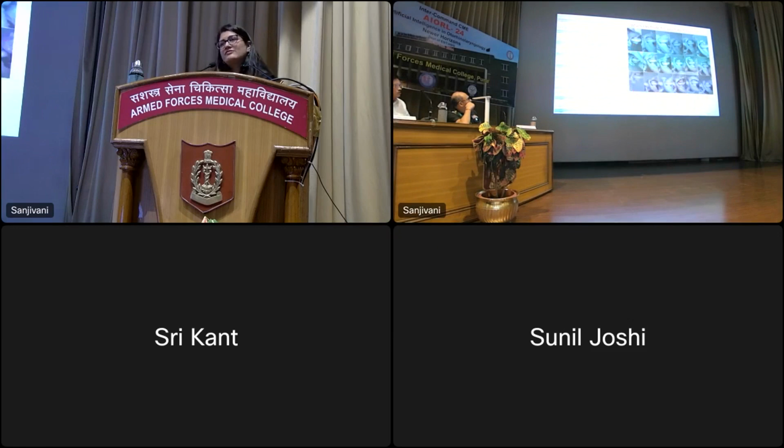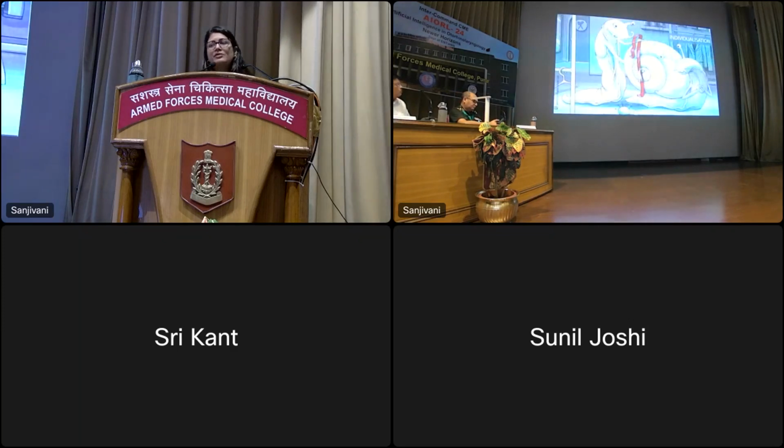So we need to understand the cochlear anatomy properly first. We need to take care of the parameters of the cochlea first to understand what insertion depth you're going to get. In general, on average, there is always a number, but that number is not good for everybody because the cochlea, like I said, is a measurable entity. We need to measure it and individualize the treatment. That is what we are giving through a cochlear implant.